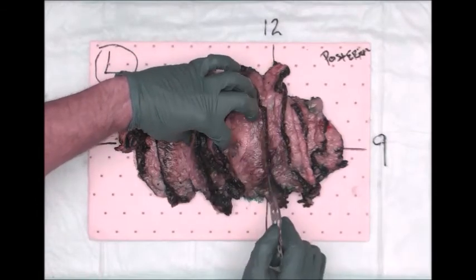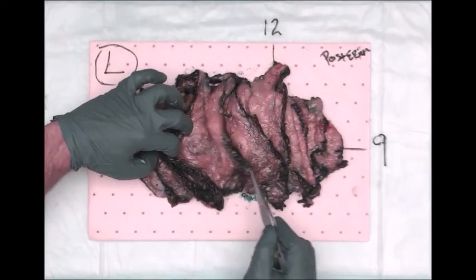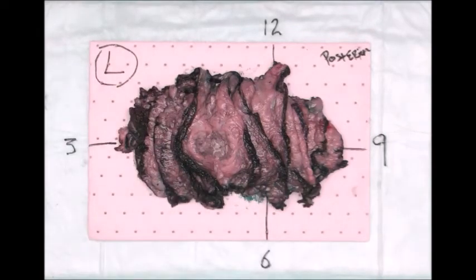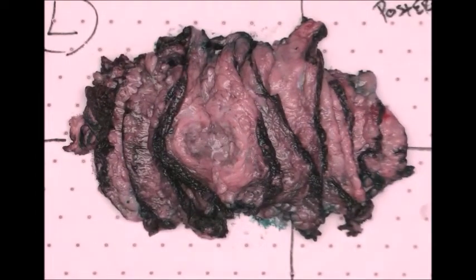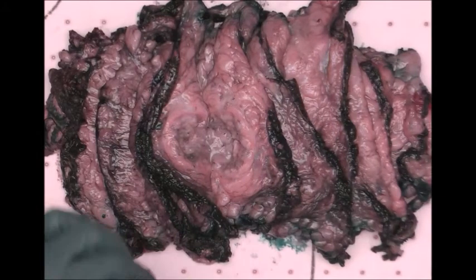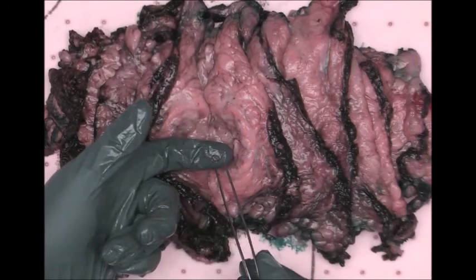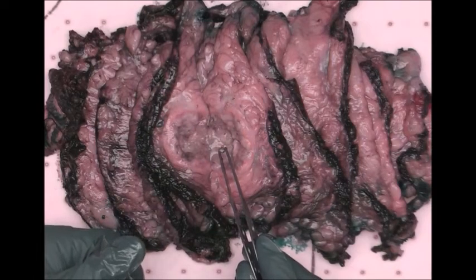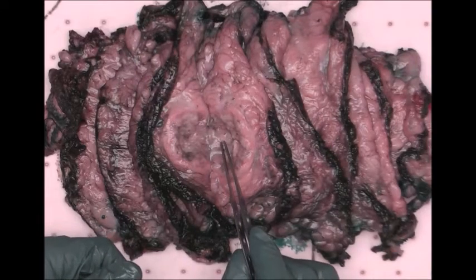Okay, so we've got this centrally necrotic indurated mass here, and as I was also cutting through and palpating within the mass, actually I'll zoom in. Within the mass was a circular shaped marker, which I expected to find after doing the radiograph of the specimen, which I'll show you here in a little bit. So here's the marker, okay? I'm going to put that to the side and try not to lose that. But there is a marker associated with this mass.